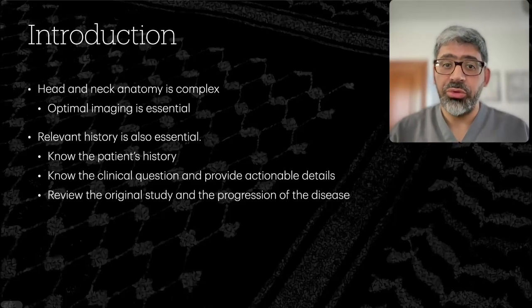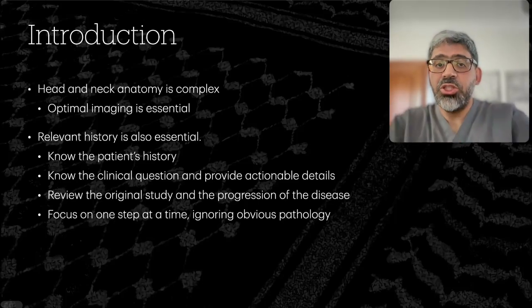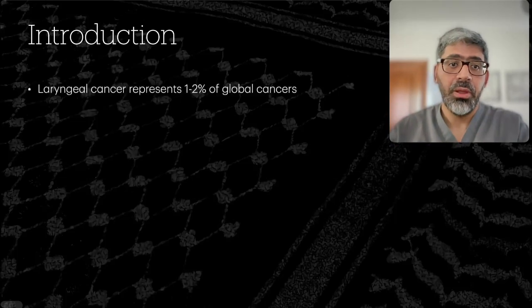We always need to review the original study and the progression of the disease if we are doing follow-up scans. Sometimes, given the complexity of the imaging and the details, we need to focus on one step at a time, do a systematic approach, and maybe even ignore the obvious pathology initially.